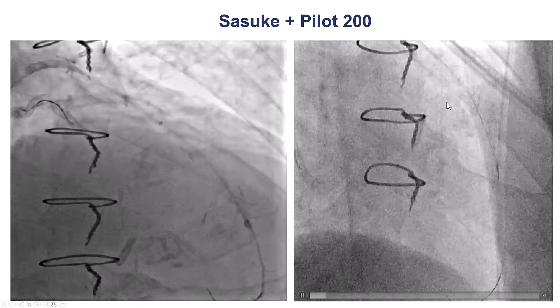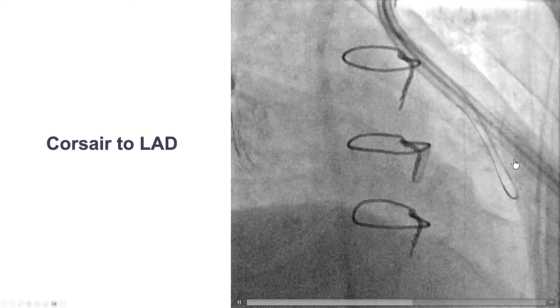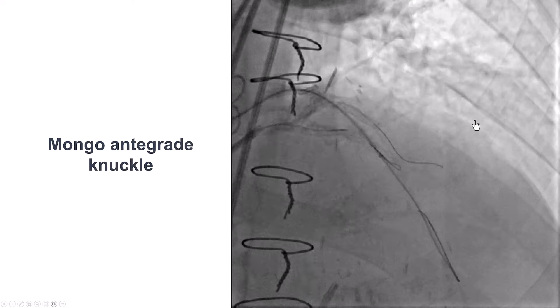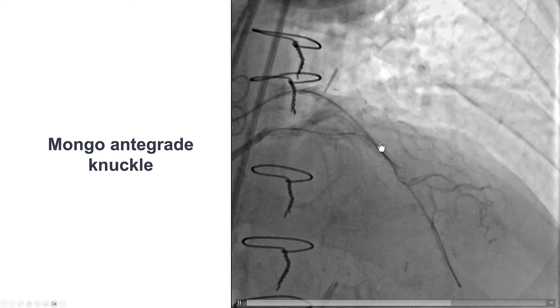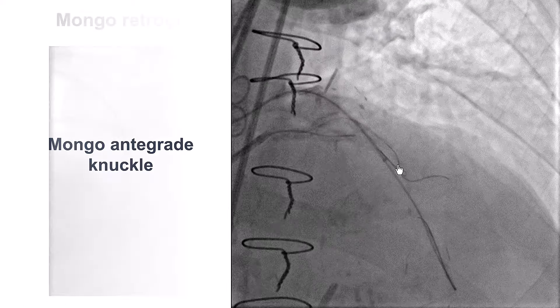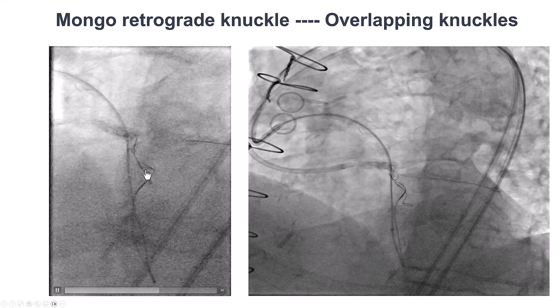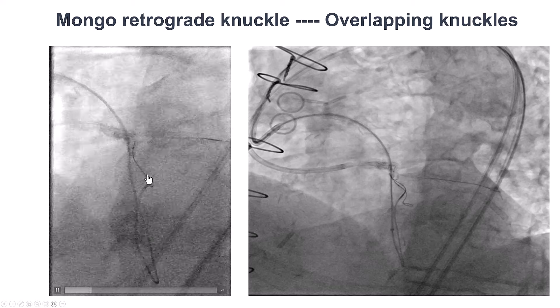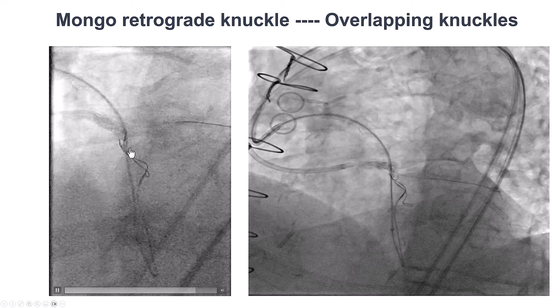The wire goes retrograde. We advanced the Pilot 200 enough to allow us to advance a retrograde Corsair microcatheter next to the distal cap. We then performed antegrade dissection, using a Mongo guidewire that knuckled into the occlusion. We used the antegrade knuckle as a marker to advance a retrograde wire — a retrograde Mongo — and now we have overlap of the retrograde and antegrade knuckled guidewires.